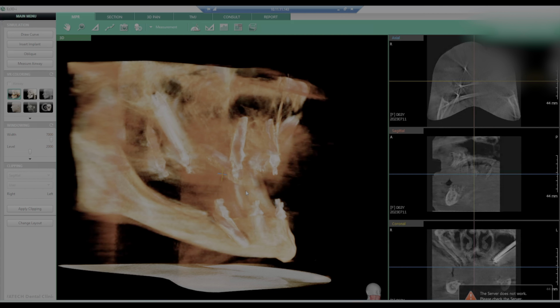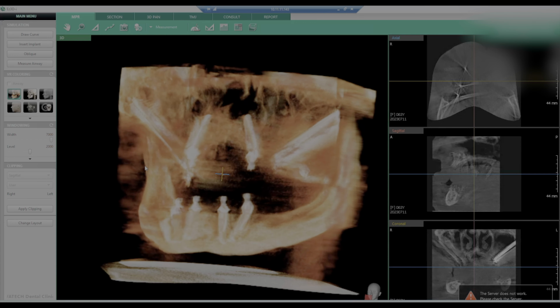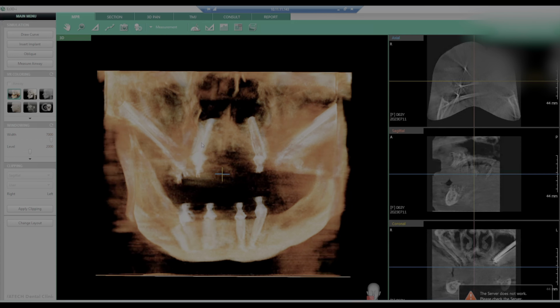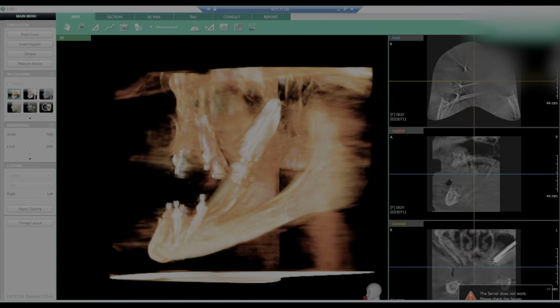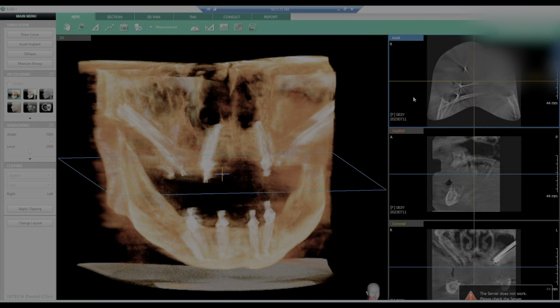So number one, what we could do is, I want to give you a small little example of zygomatic implants and pterygoid implants we had on a patient who visited us from North Dakota. This is her. She had very large sinuses. So what we did was we did some zygomatic implants on her, and also what we call pterygoid implants on her. And so we actually finished her up, and she had a great result.